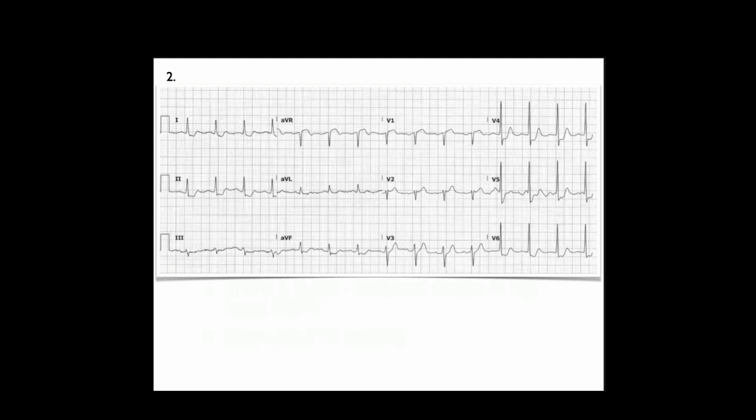Okay, Kyle, number 2, please. I see depression in 1, 2, and 3 is really wonky and kind of hard to see. It does look like you have a bit of a flat segment there, but because the isoelectric line's so weird, I don't know if I can call it depression, but it definitely has a flat segment.